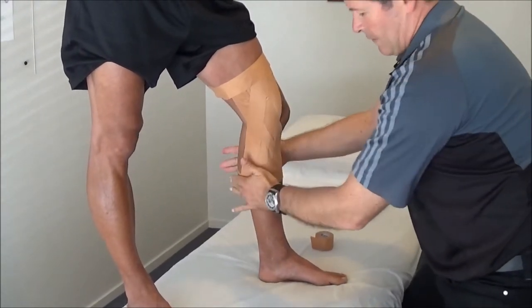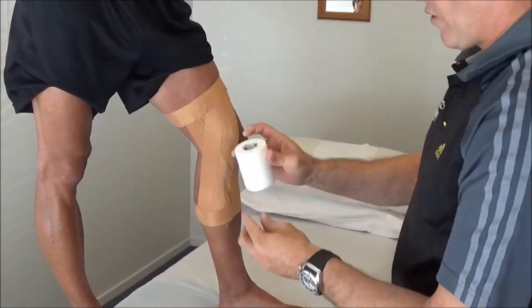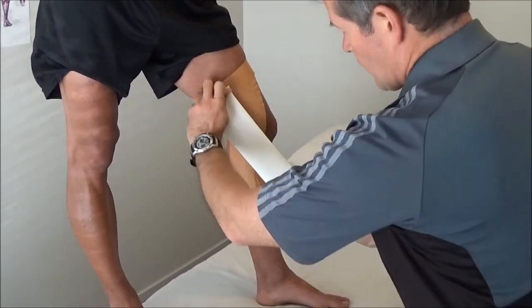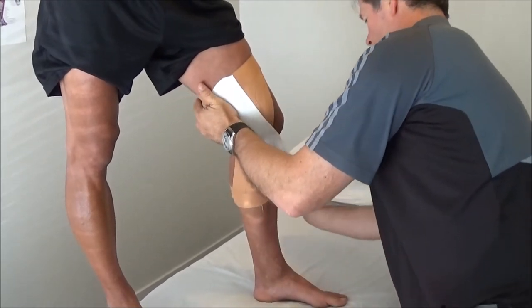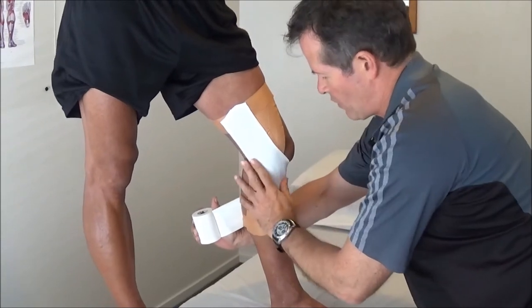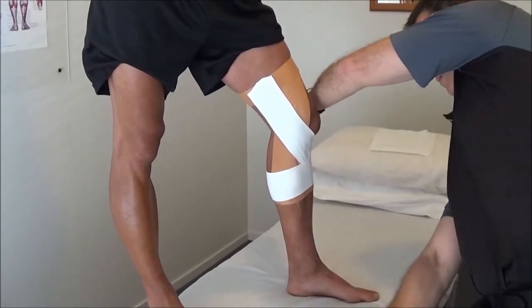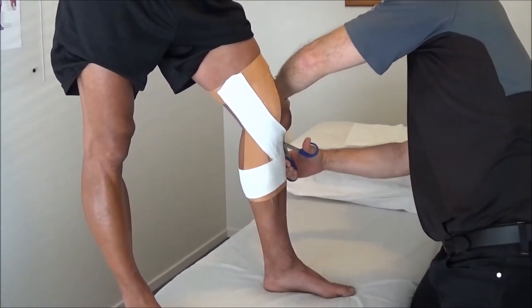Now I want to put a bit of strapping over the top of this, so we'll use a 75mm or 7.5cm elastic adhesive bandage. We'll start at the top and come around, and I'm going to show you one technique which uses the minimum amount of tape, and we're going to cut this off like that here.